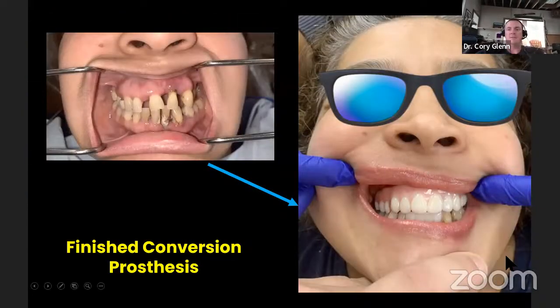And this was that patient when she bit down for the first time. So that really speaks to the accuracy of this process, is that's her occlusion right out of the gate. Now, going back to my argument earlier, if you have gone to the trouble of putting metal reinforcement into this where it's going to be super strong, or maybe you fiber reinforced it or Trilor or whatever, if you nailed the aesthetics with this, tell me why, if it has reinforcement, this couldn't be the final. And you won't be able to think of a reason because this can absolutely serve as the final.